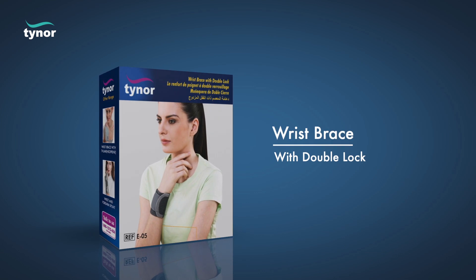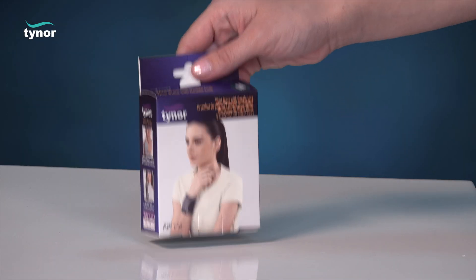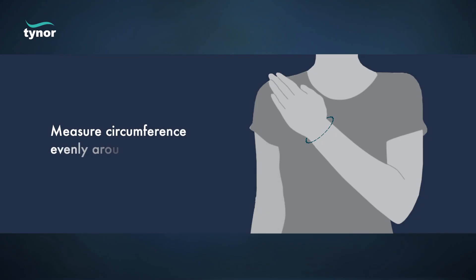Here we will discuss how to measure the size and how to wear the wrist brace with double lock. The wrist brace with double lock is available in these sizes. Measure circumference evenly around the wrist joint.